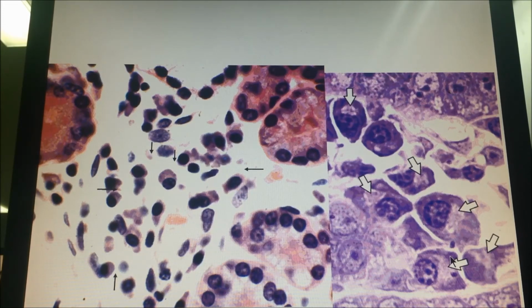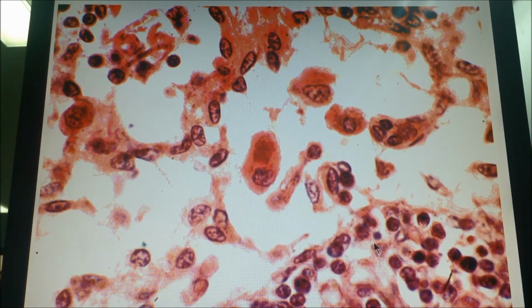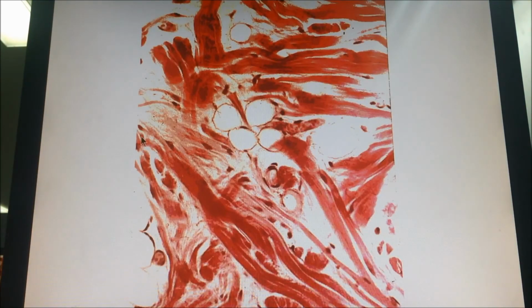Okay, it's derived from a B lymphocyte that migrated into the tissue and differentiated into a plasma cell. The section before is the same thing but not very clear. يعني يمكن هون شوي more clear تحت نشوف السمول بلازما cell with the nuclei at their clock face appearance. But at least you can know from this tissue this is also an inflamed tissue with a large amount of plasma cells.